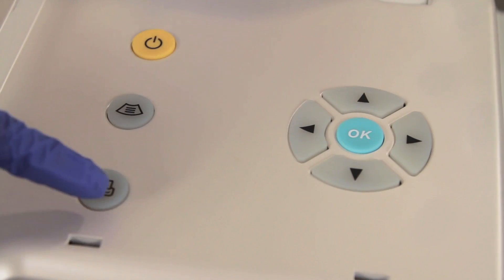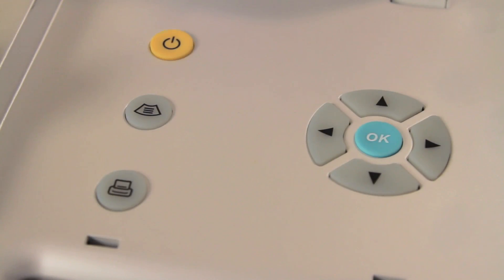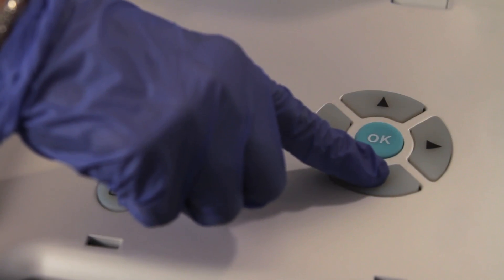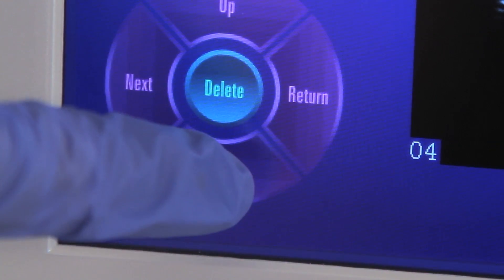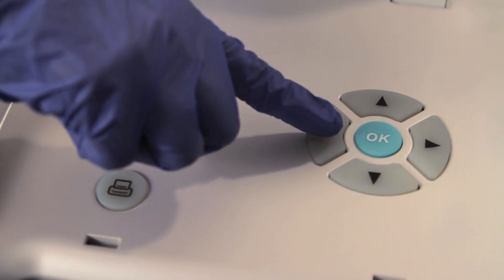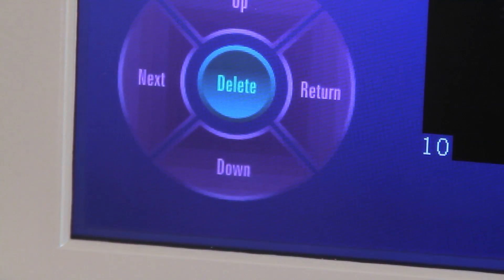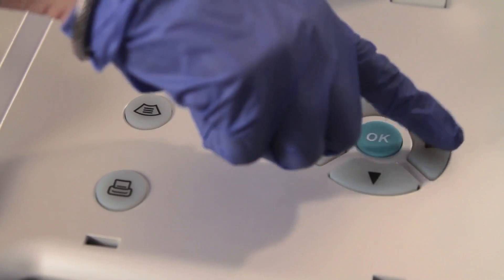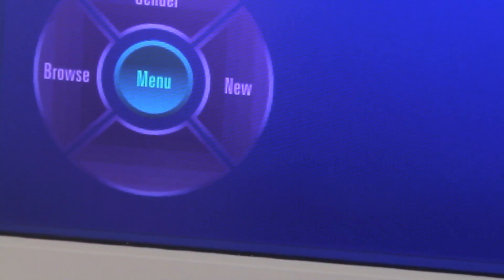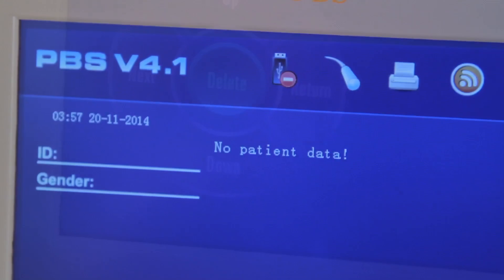Press the Printer key to print the current record being displayed. Press the up directional key or touch the Up functional key to display the previous record, and press the down directional key or touch the Down functional key to display the next record. Press the left directional key or touch the Next functional key to display the next six images. Press the right directional key or touch the Return functional key to return to the Ready screen. Press the OK key or touch the Delete functional key to delete the current record.